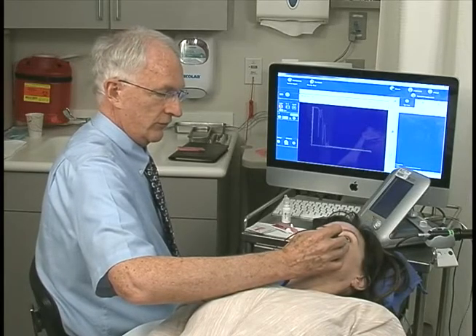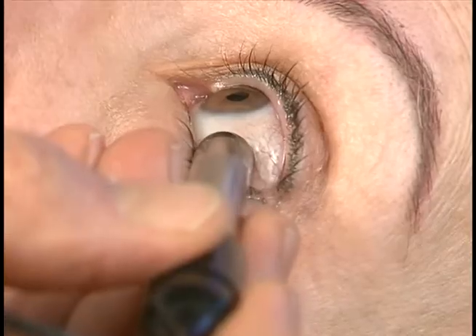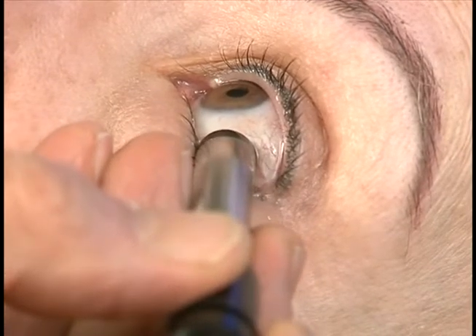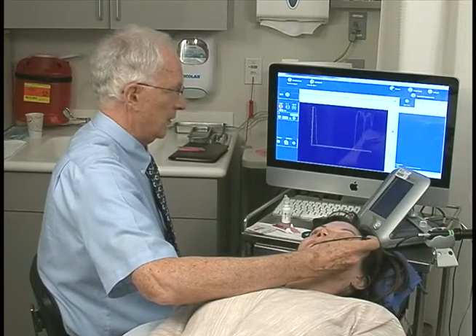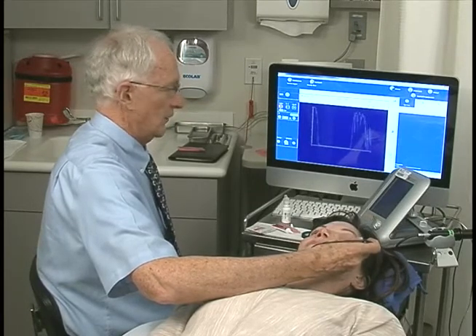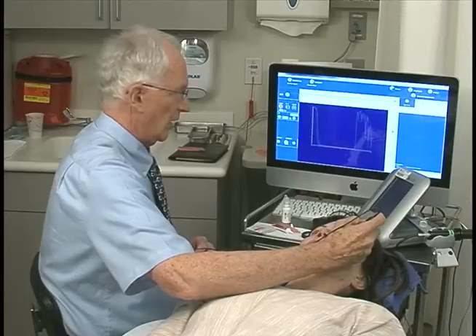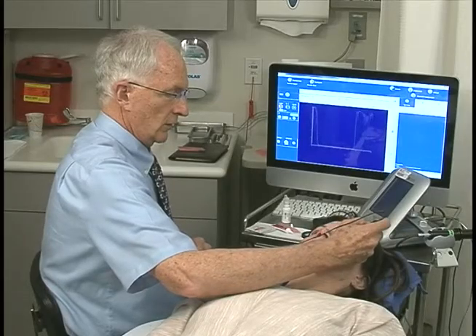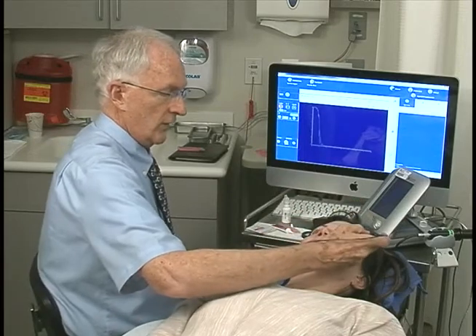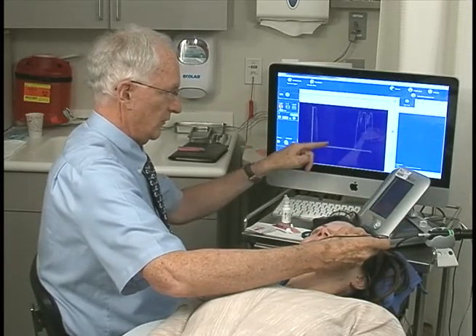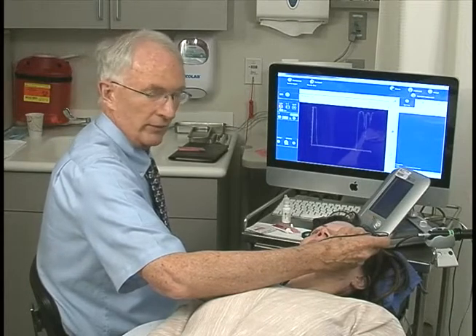This is the 6 o'clock position. I then move over in the left eye to the 4 o'clock position and do the same thing. I aim the probe almost posteriorly and get a spike from the initial signal. As I angle it, I try to maintain the fundus spike in a perpendicular manner until I break down as I approach the ora serrata. I then go to the 2 o'clock position and do the same thing, angling from the posterior segment more anteriorly to the peripheral retina. By doing that, I scan the entire inner contents of the globe, watching the vitreous for any spikes and watching the fundus spike for any low reflectivity indicating a possible lesion such as a tumor.